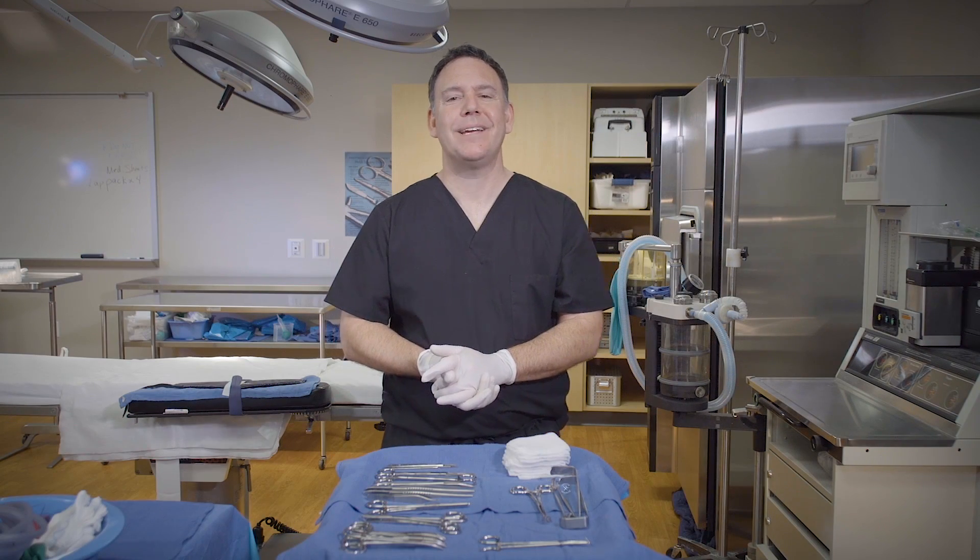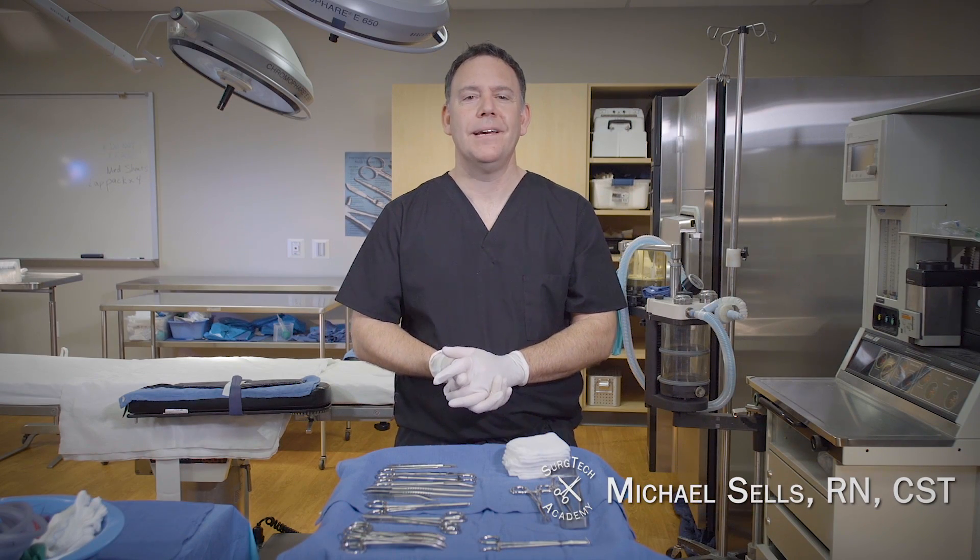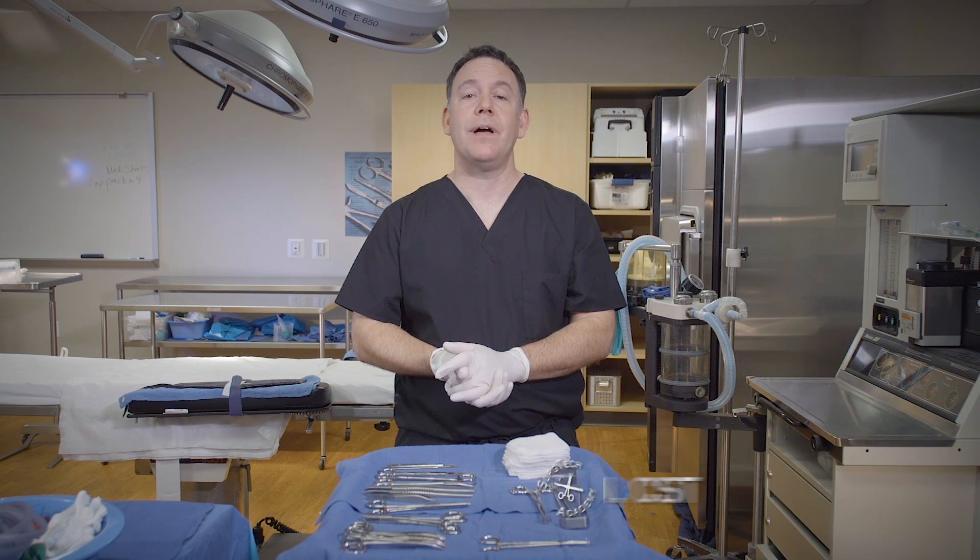Hello everybody, Mike here from Surge Tech Academy, and today I'm going to demonstrate basic instrument passing with and without hand signals.